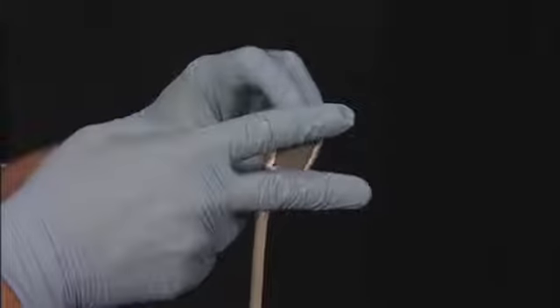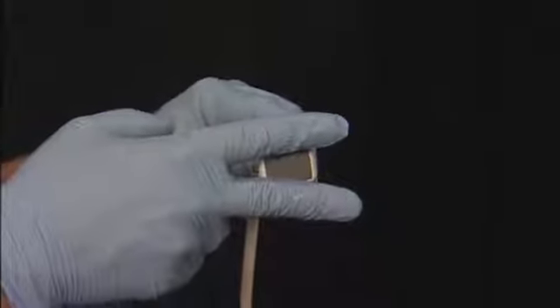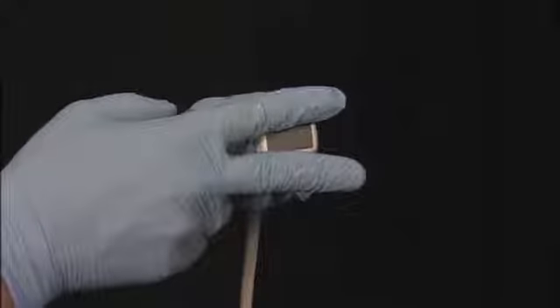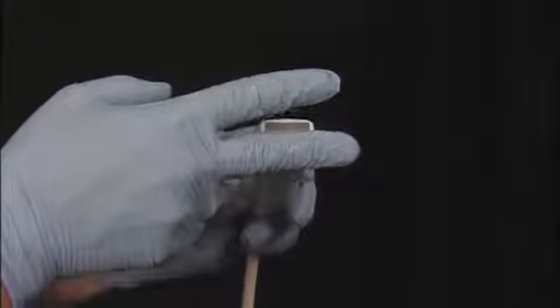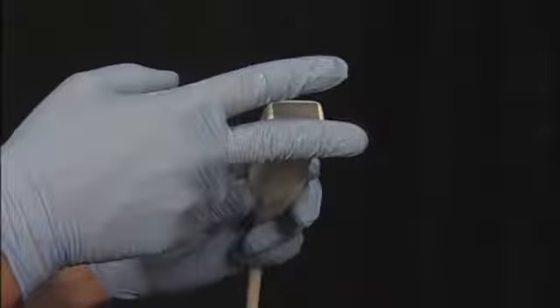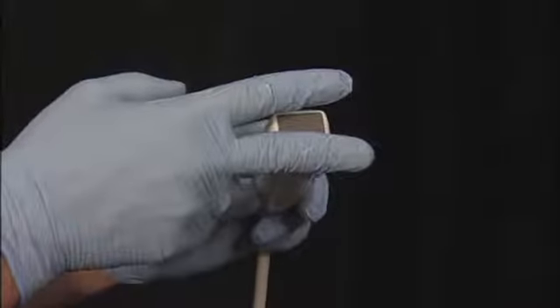The other thing that is important is that if you need to tilt the transducer, you will have the problem that you will obscure your view if you tilt it this way. So in this case, you'll have to move down a bit, move away from the ribs, and then you will get a good view in between the intercostal space.